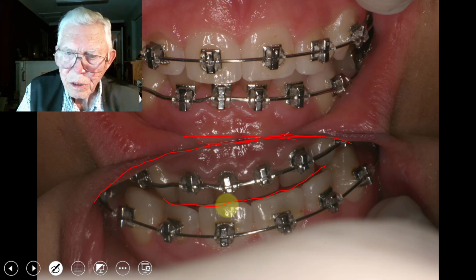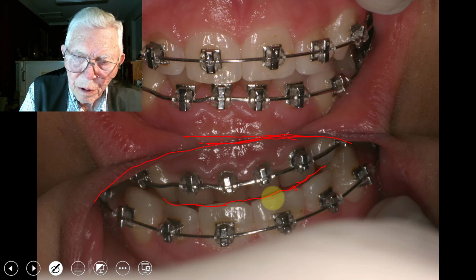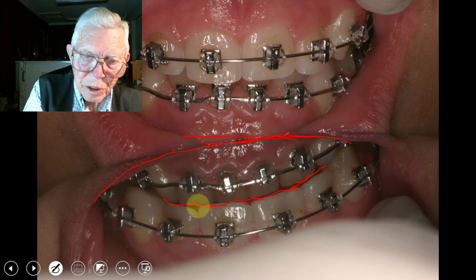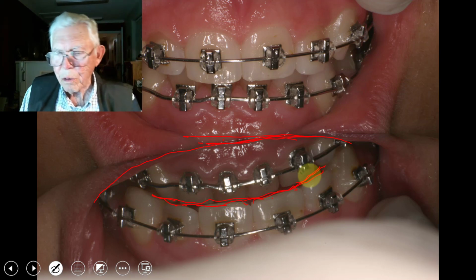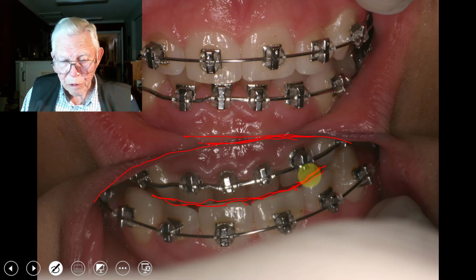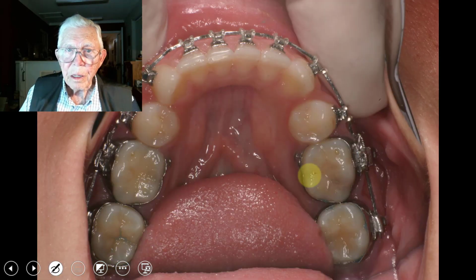Now these teeth are lined up, and there's no bumps or increase in the size of the teeth right in here. Everything's lined up good. So anyway, I've got the record of that, you don't have those cingulums or margins of the teeth that are trying to rotate that back. Okay, and in here we still haven't got that done.